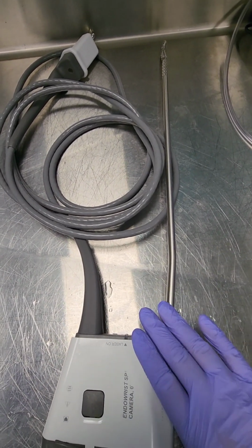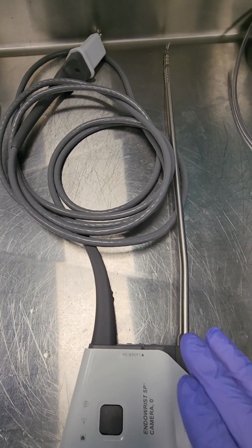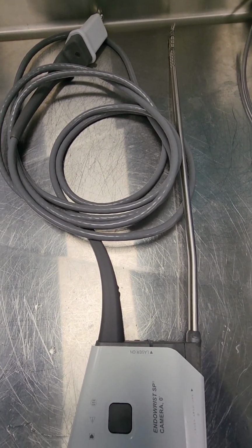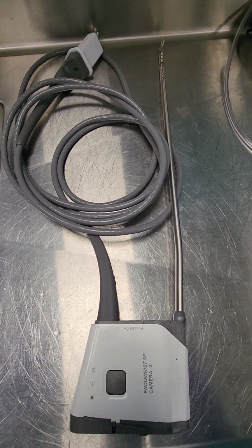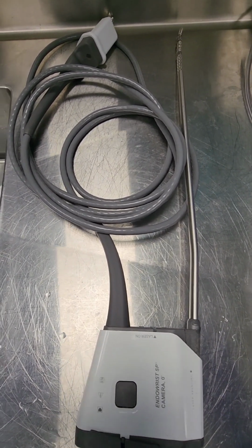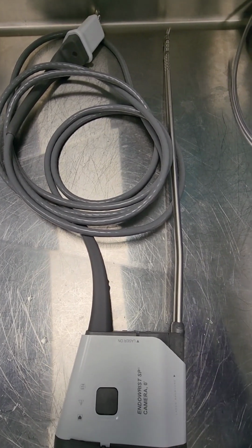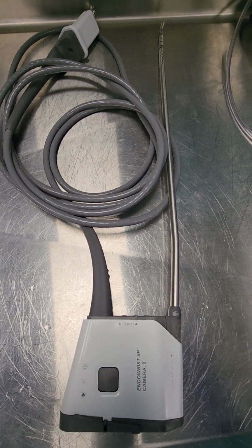All right, you see me process an XI. Now we're going to process an SP. Now, the cleaning process follows the IFU as the XIs. You're going to rinse to remove any pre-treatment, loose bioburdens. You're going to go ahead and prime your ports and soak your instruments.